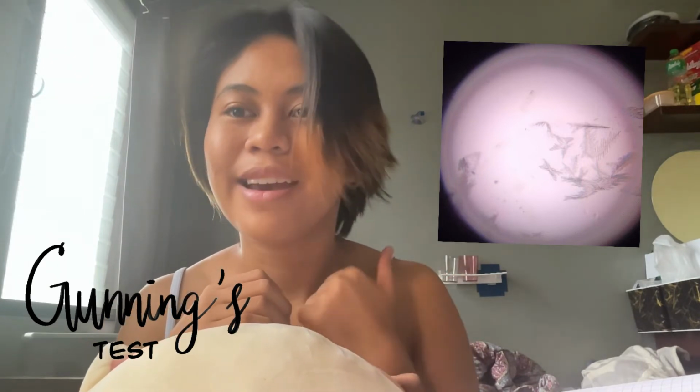We let that stand for a few minutes for the precipitate to form, and then under a microscope we examined the sediment. What we saw in the microscope would be seen here. So yes, that's Raymond's pee.